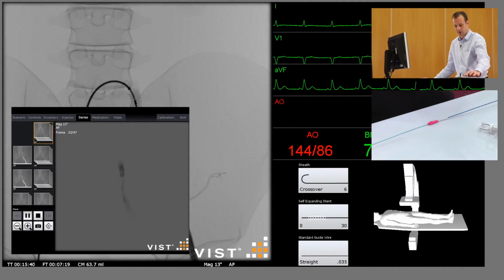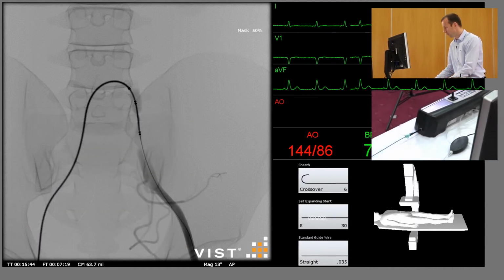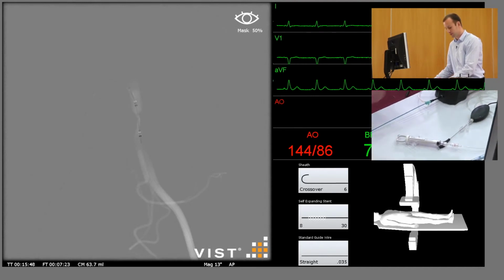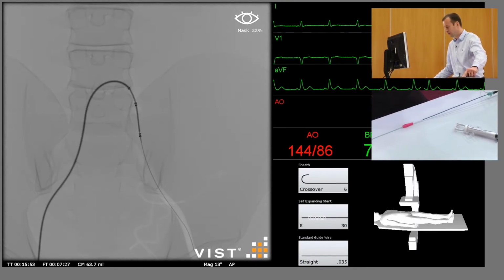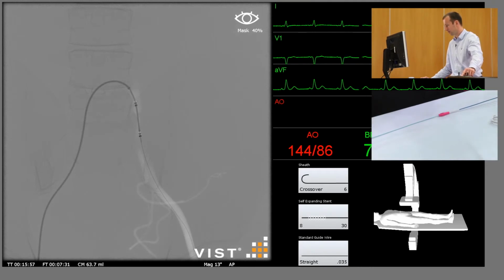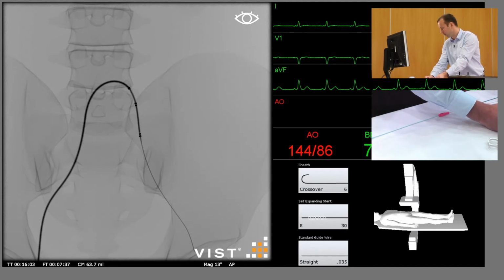And this will show us that the stent needs to be advanced very slightly. We can fade the image in and out to demonstrate the correct positioning, but then fade all the way out to deploy the stent.